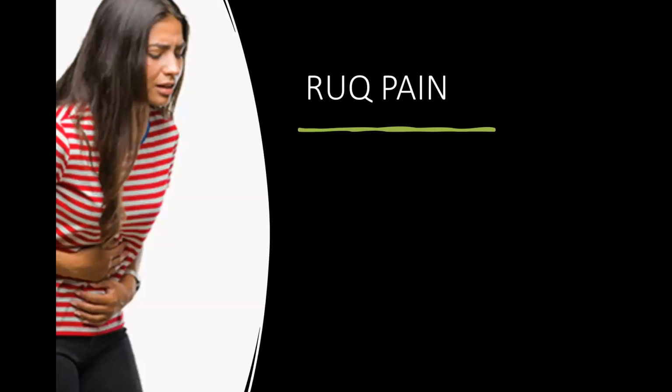So we have a patient, 38-year-old female with right upper quadrant, a little bit of epigastric pain. And of course, we're a bunch of sonophiles. So the first thing we do when she comes back from triage is grab the ultrasound and we look at the gallbladder, of course.